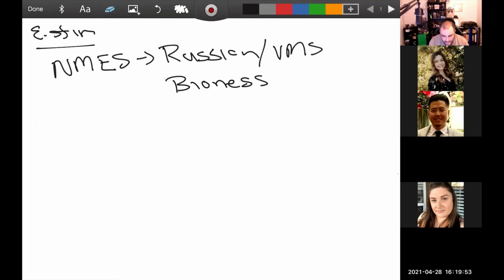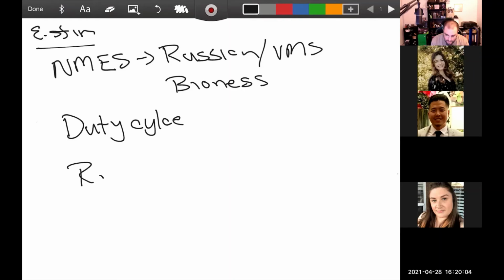With Russian or with NMES, you do still have a duty cycle. You have a couple of things. You have a duty cycle and you have a ramp time. Does anyone remember what the ramp time is? 2 seconds. Yeah, 2 seconds is normal, good. But what does it mean? What is 2 seconds? It means it gives them time to get adjusted to how strong it's going to be.